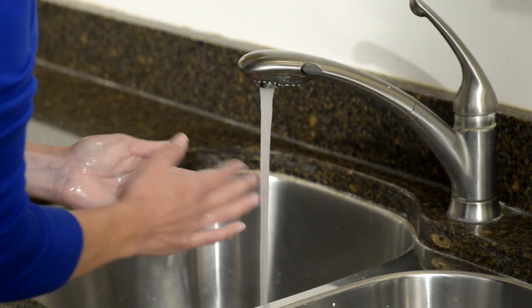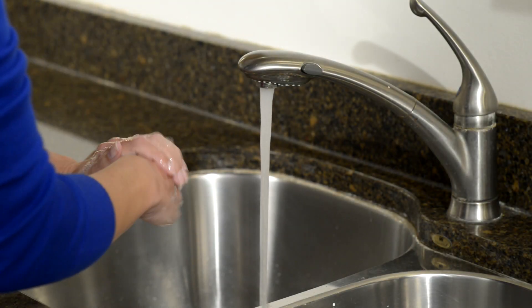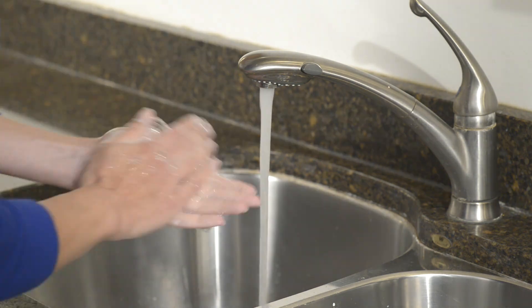To start, wash your hands with soap and warm water, then rinse and dry thoroughly. You are now ready to begin.